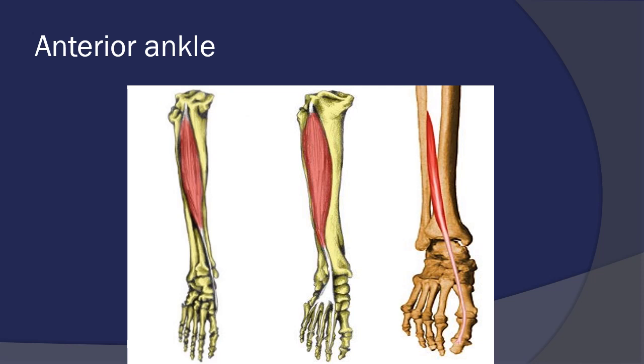Regarding the examination of the ankle by ultrasound, we examine the joint anteriorly, posteriorly, medially, laterally, and it's very important not to forget the inferior aspect to assess the plantar fascia.